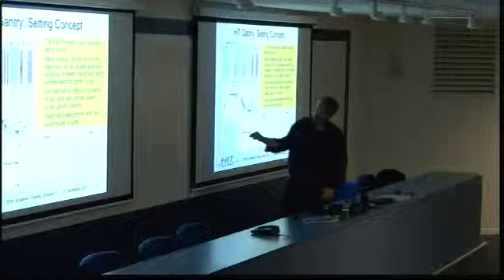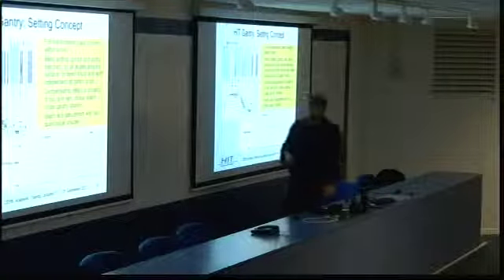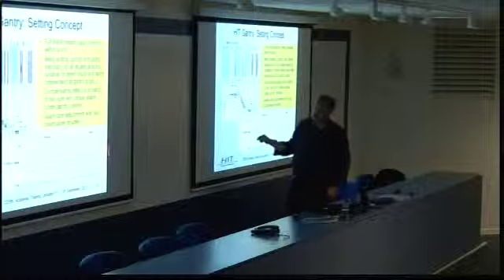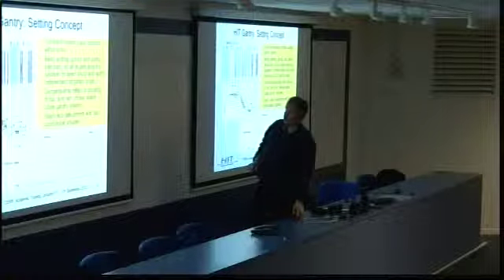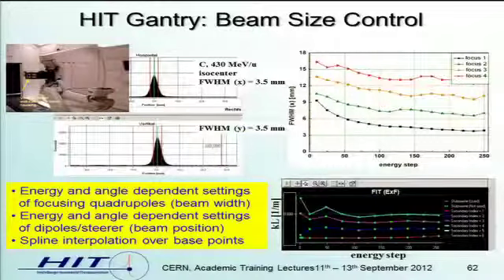So full width at half maximum in this case of about 10 millimeters with plus minus 25% deviation possible. But still you see a little bit the sinusoidal structure for the deviations, which is hard to bring really to a minimum. But nevertheless, this is the result. We can have the same beam sizes as at the horizontal places.